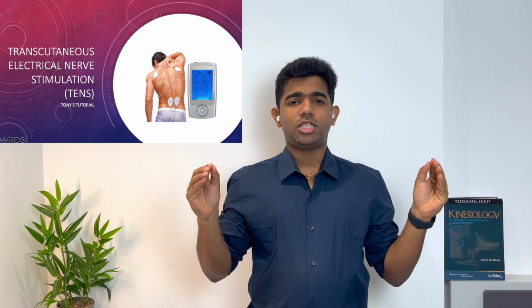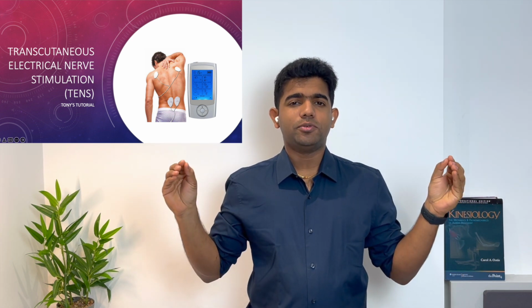As I told you, TENS stands for Transcutaneous Electrical Nerve Stimulation. The word itself gives you some hints: it's an electrical stimulation, but it's an electrical nerve stimulation, so the nerves are being stimulated. TENS is an electrotherapy modality that is used to stimulate the nerves to have some effects. We'll see what effects that has.